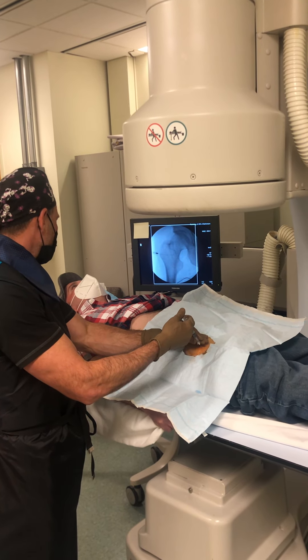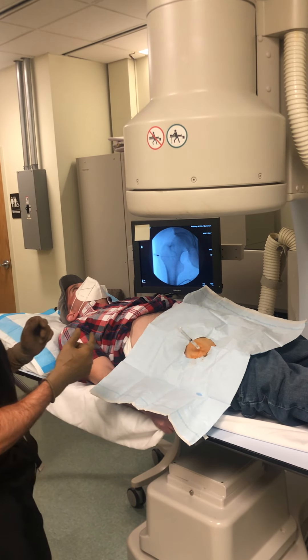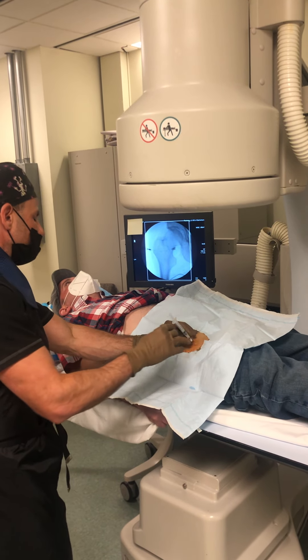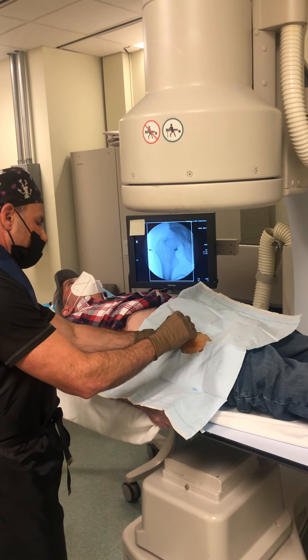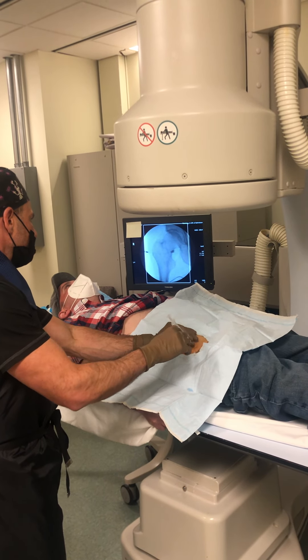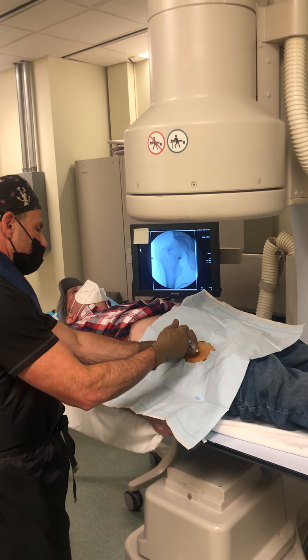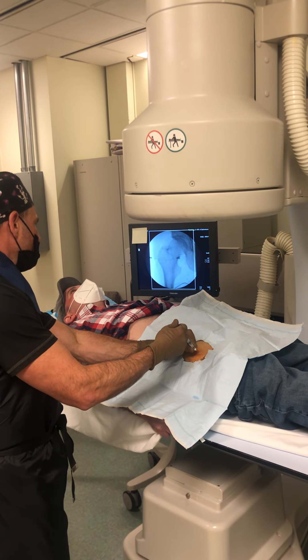You're going to feel a little bit of pressure there. You all right? Yes, sir. A ton of pressure.